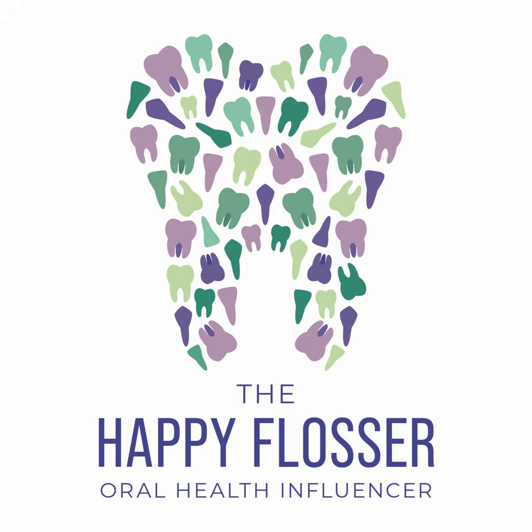And then the most dense item that we take a radiographic image of is metal. Now think about your metal restorations. The molecules on those metal restorations are really close together. So those are the most dense items that you are trying to take an image of. So the radiation cannot penetrate the metal. It is the most dense item that you take images of.